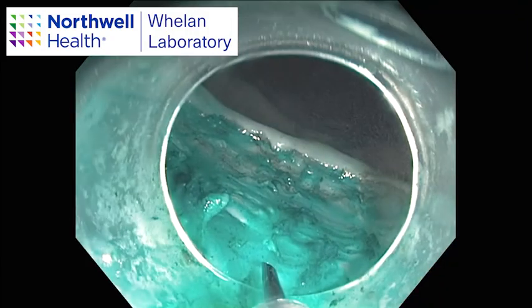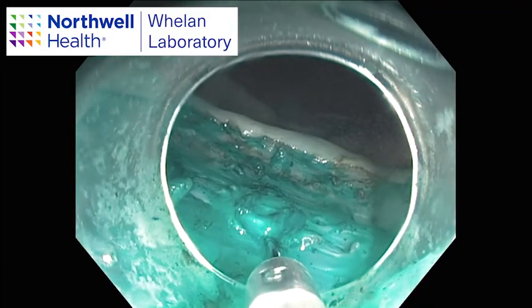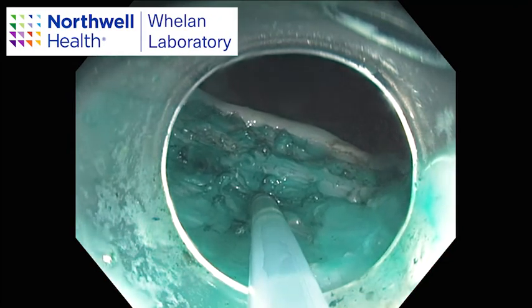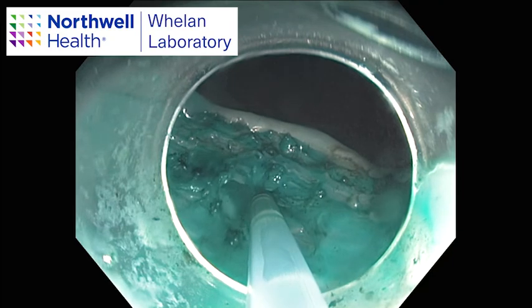Here we see an additional video clip showing an injection being made directly into the muscularis propria in bovine colon after an ESD has been performed. The expansion of the deep layers can clearly be seen.